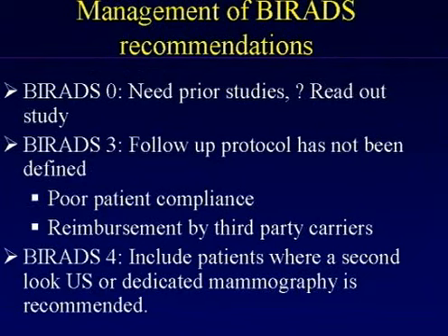So again, what have we learned from these BIRADS lexicon? If a BIRADS 0, this is where you need the prior studies, the prior mammogram, ultrasound, and MR. When I first started, I was a stickler. I wouldn't read the studies unless I had those old studies. Truthfully, sometimes we never get them. So now I read these studies out as they come across. And then if there is a finding, I will then give it a BIRADS 0 and say that I do need the prior studies to give a definitive read.